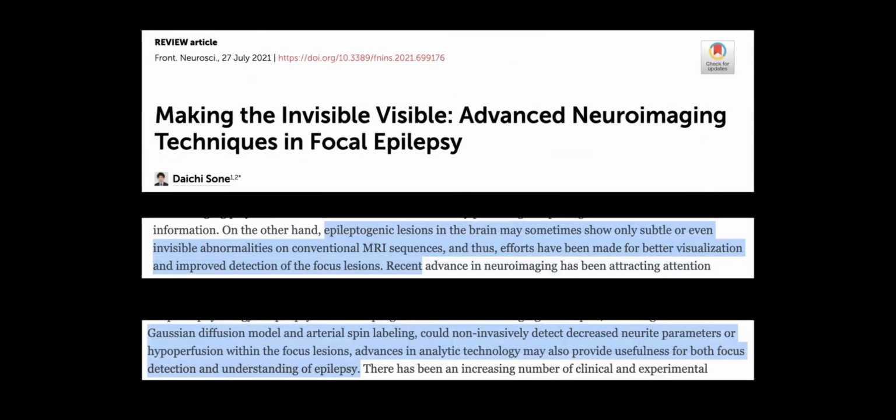And of course, this is not a new idea. This is not an idea that we just talk about with traumatic brain injury. We talk about it with other conditions in neuroradiology and neurology, such as epilepsy. Epilepsy isn't always due to traumatic brain injury, even though there's a tight link between the two. Epilepsy can often arise due to other reasons. They can be congenital, they can be due to other underlying causes. But the idea that we can use advanced neuroimaging, imaging that goes beyond conventional structural assessments, to identify abnormalities in the brain is something that's been written about in other literature.